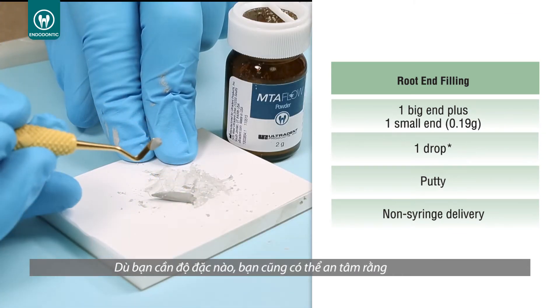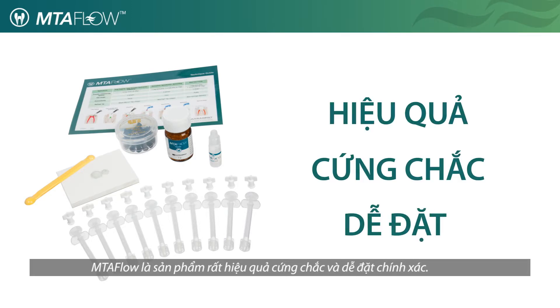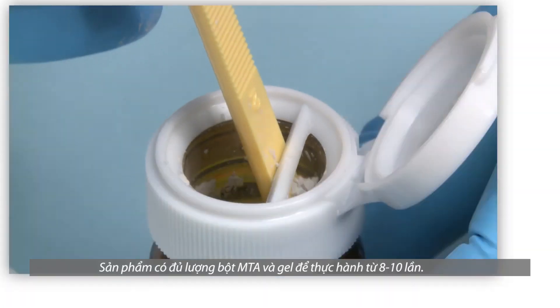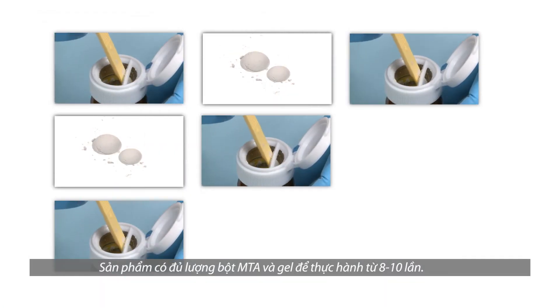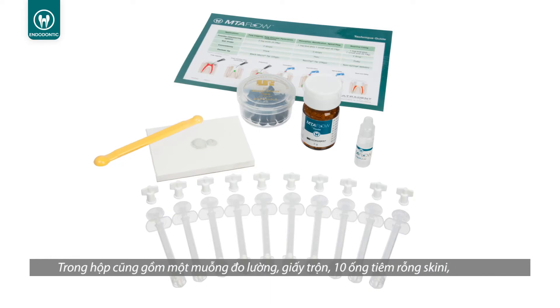Whatever consistency you need, you can be sure that MTA Flow will be effective, non-gritty, and easy to deliver accurately. The MTA Flow kit also includes the essential tools needed to mix and deliver the cement. The kit contains enough MTA powder and gel to complete 8 to 10 applications.